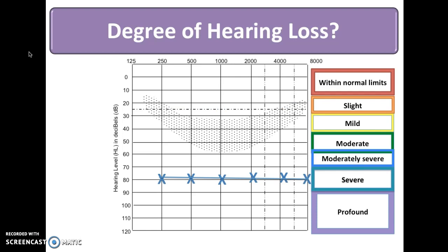Let's review another example. In this example, we see left ear air conduction thresholds, which are represented by the X, fall within the severe hearing loss range. Let's look at one more example. Here we have right ear air conduction thresholds on the audiogram. These air conduction thresholds for the right ear fall within the moderately severe hearing loss range.